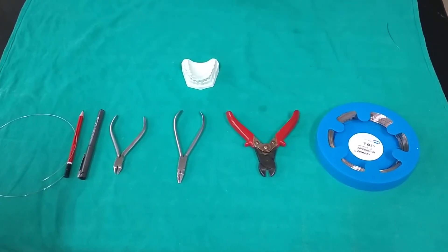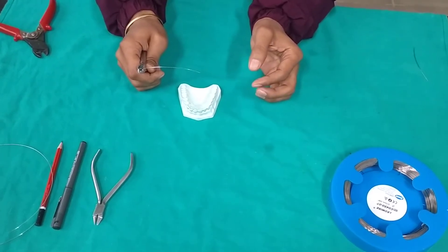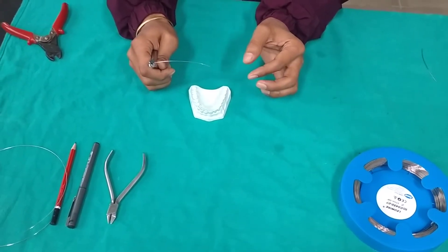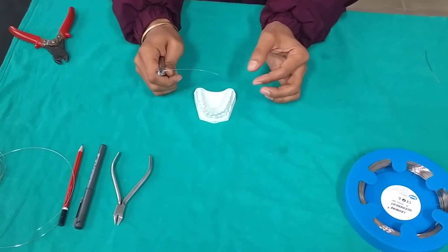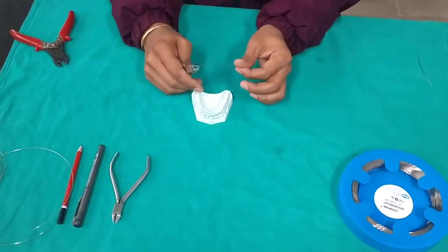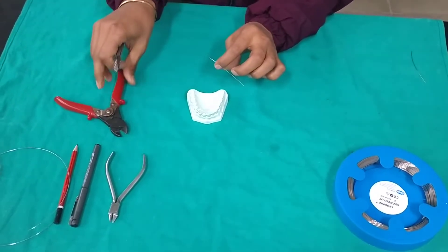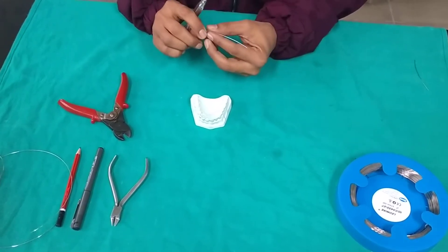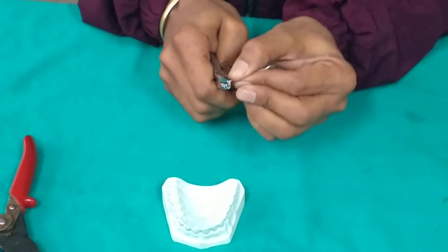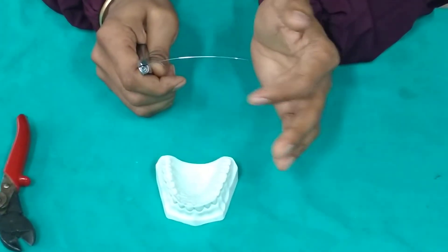The armamentarium we need includes 0.5 mm stainless steel wire, universal plier, wire cutter, and a marker. For the Z spring we need a 0.5 mm stainless steel wire, and we are cutting a small segment of it.